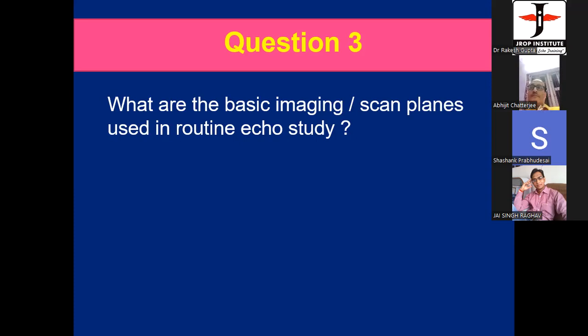Okay. Subcostal window? Subcostal view, four chamber, sir. Subcostal four chamber view and IVC view. Yes, sir. Just keep on remembering it, okay?